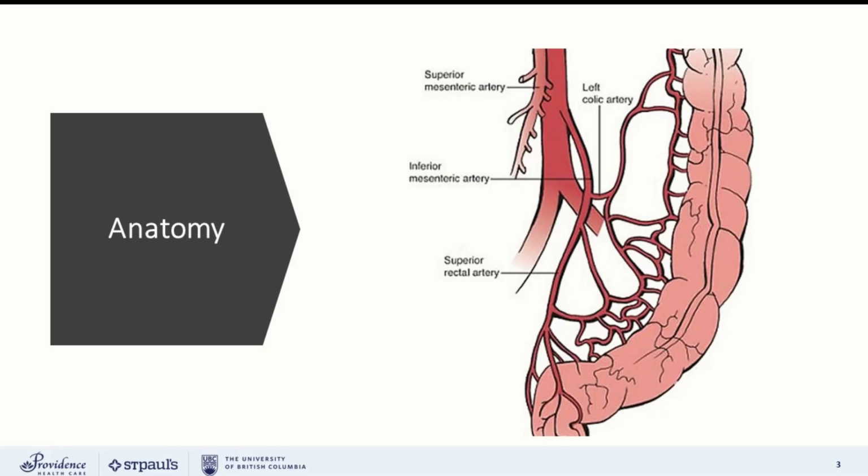The first is that obviously these are not really my tips and tricks. These are the tips and tricks that I picked up over the last 2 years from working with the wonderful staff at St. Paul's Hospital during my fellowship, so I want to thank them. And the second is that there's obviously many ways to do this operation, lateral to medial, medial to lateral. There's many tips and tricks within the medial to lateral approach as well too, and one should be familiar with all of them. So having said that, here are a few of our tips and tricks.